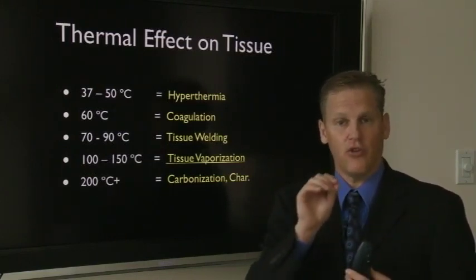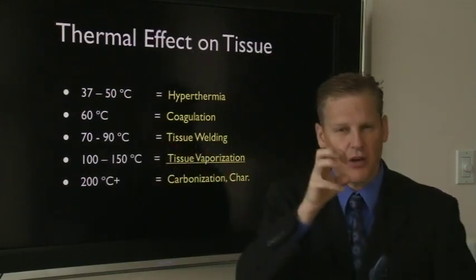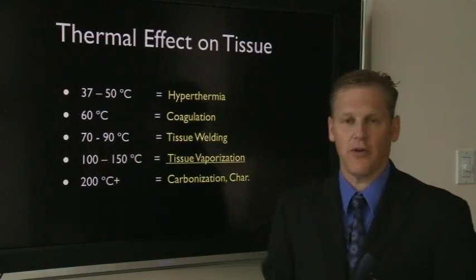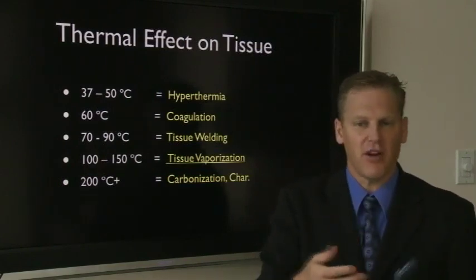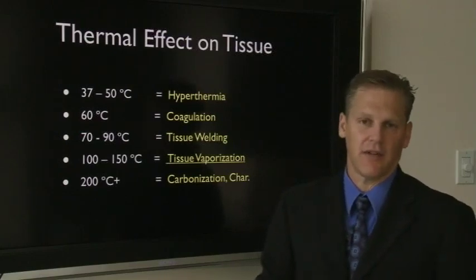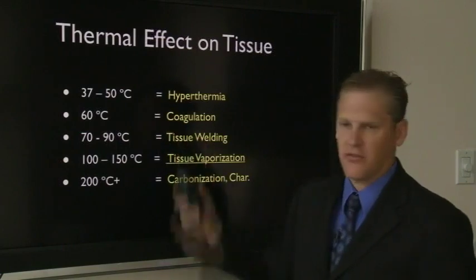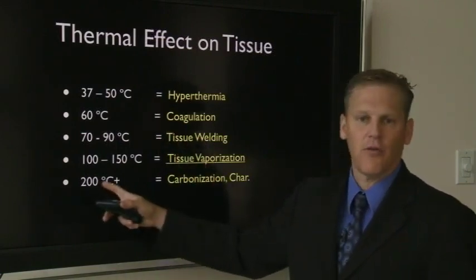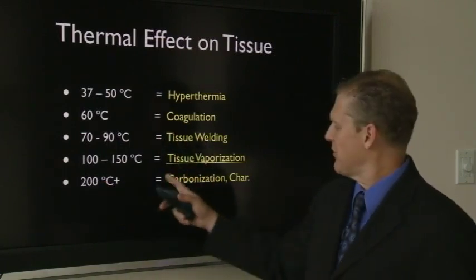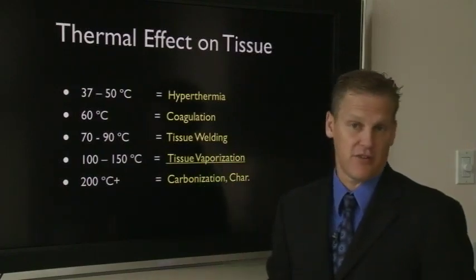If you notice that you're not getting a zone of vaporization, but the tissue is kind of gloopy, gluing onto each other, getting a white sort of slough, but it's not actually cutting, you're probably not getting up to a high enough level to cause vaporization. So again, this gives you a basic understanding of the temperatures necessary, and wherever possible, avoid going too high, because this is going to cause post-op sensitivity, delayed healing, and in some cases recession of the tissue.